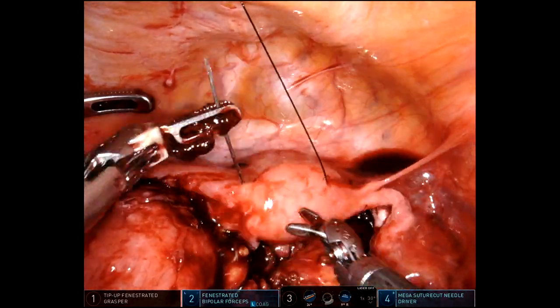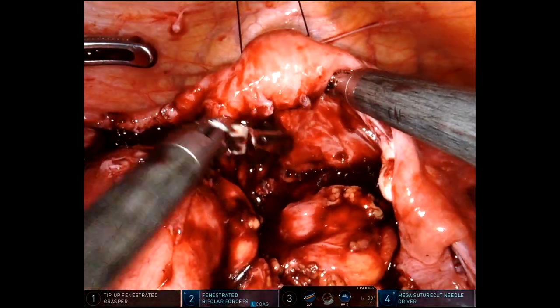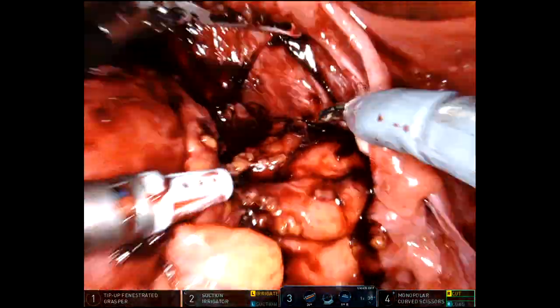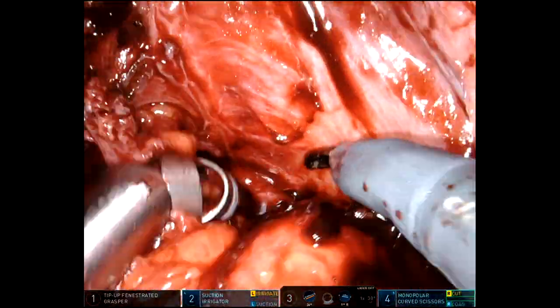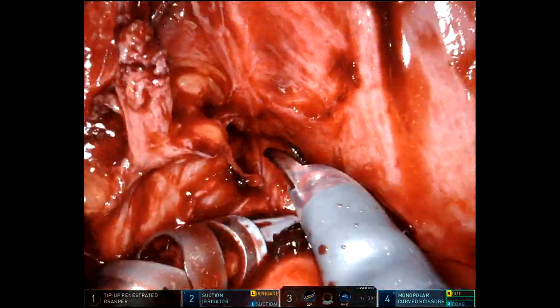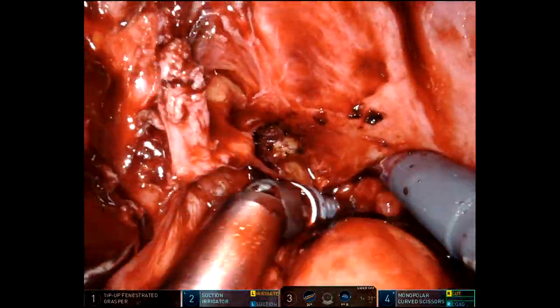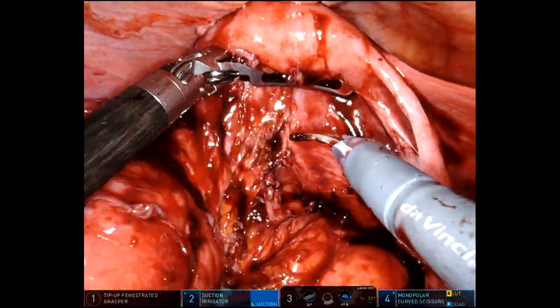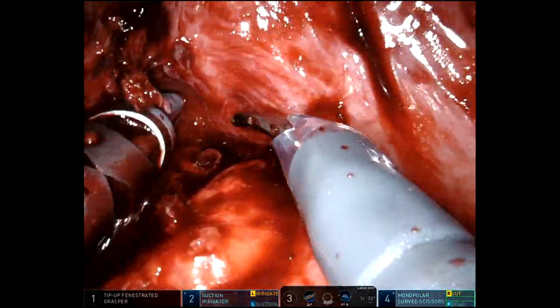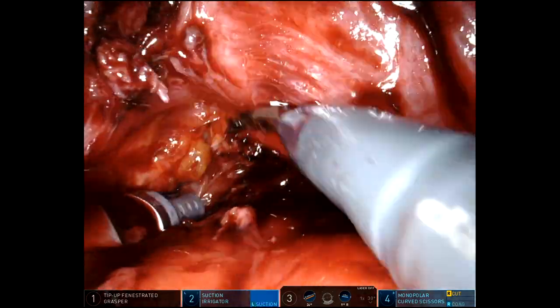Suspending the uterus frees up arm number one for retraction, and now I'm continuing to work way down deep in the pelvis. The MRI suggested there was a separate fistula down here from the loop of sigmoid to either the cervix or upper vagina. I didn't really come across much granulation tissue in this area, so I'm not sure if that was just adherence or a true fistula, but clearly there was a fistula to the left fallopian tube.